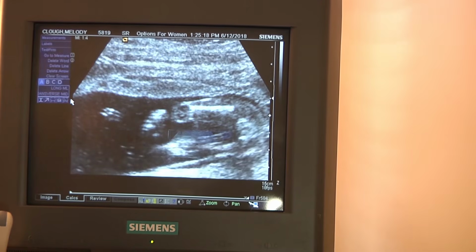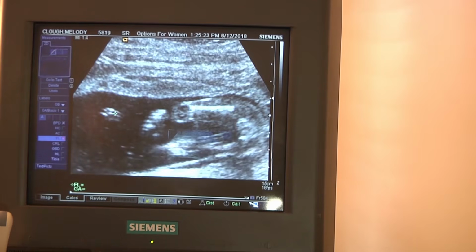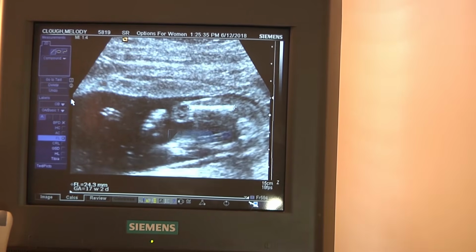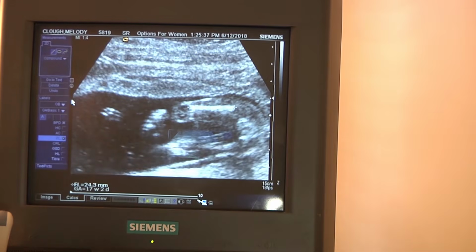So what I did after she froze it, I zoomed in on the femur. This has post-processing, so after you freeze it and you want to still zoom in more, you can do that. So what do we get? 17 weeks, 2 days. Good. But I do see the clear ends. You do. That's a beautiful femur. Very good. But you know, it's not unusual for it to be off. It's not perfect. Yeah, and it does take an average.